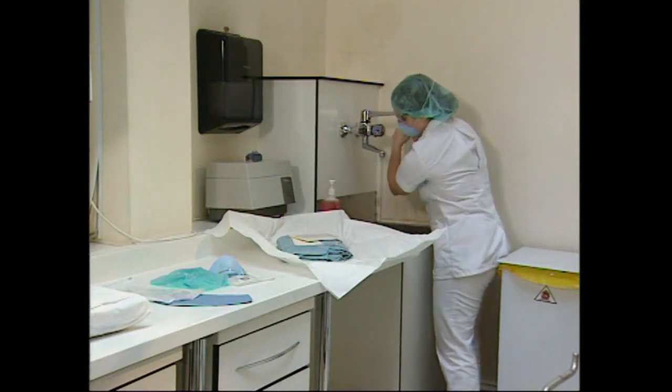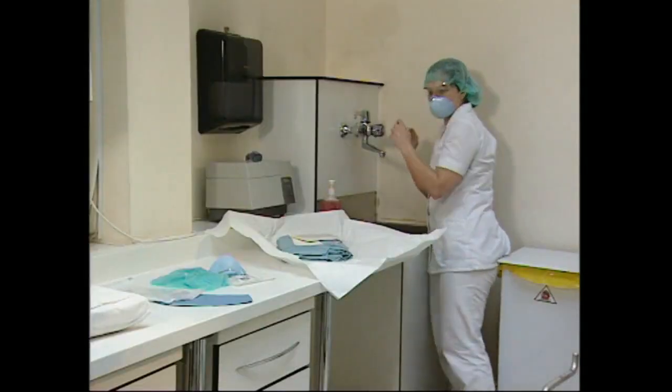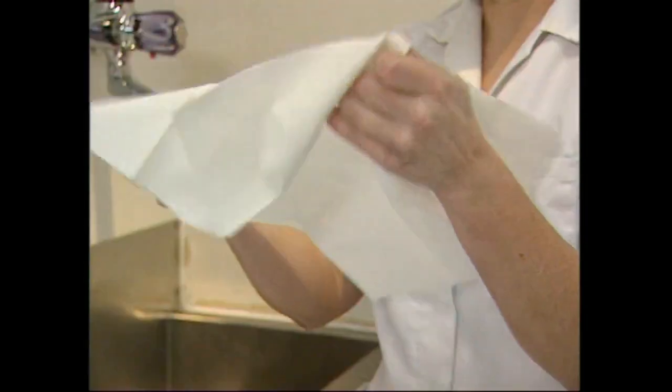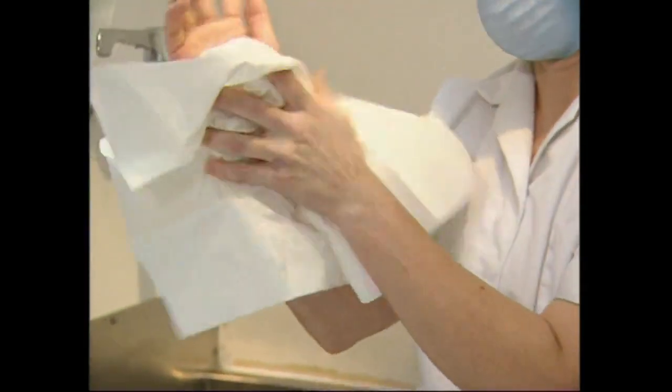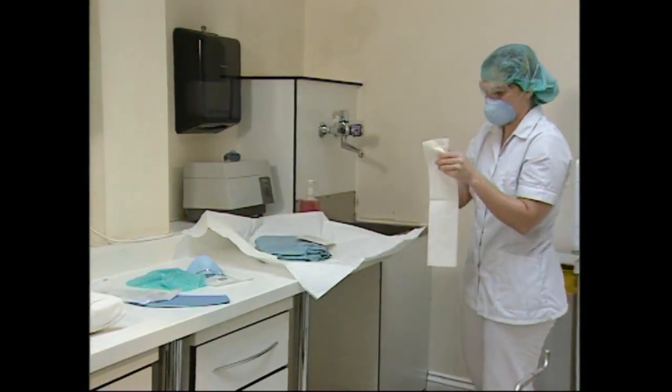The brush can also be used for scrubbing the wrists and forearms. The hands are rinsed with the water running from the fingers to the elbow. The water is allowed to drip off the elbows by keeping the hands pointed upwards. The tap is turned off using the elbow to ensure that the clean hands are not contaminated. The sterile towel is used to dry the hands, working from the hand to the wrist and then to the forearm. The towel is discarded and the second towel is picked up using the dry hand. The second hand is dried using the same sequence.